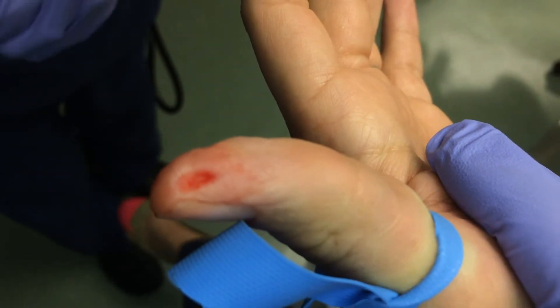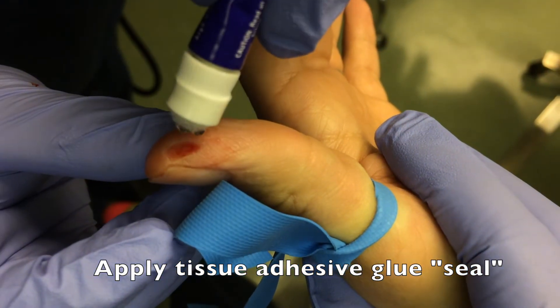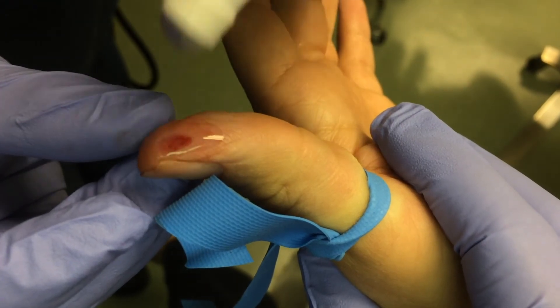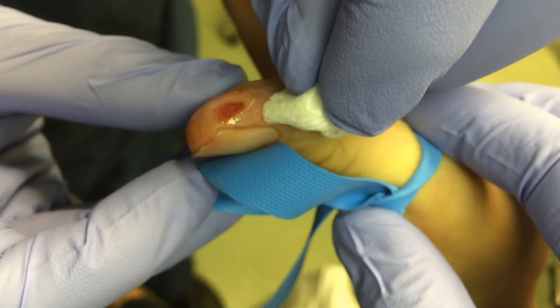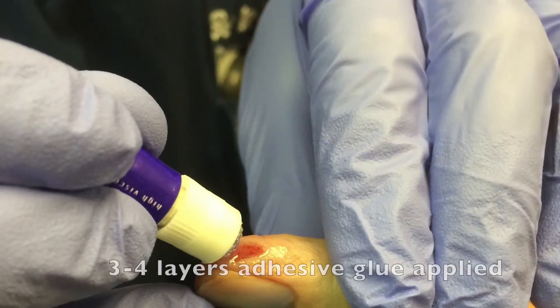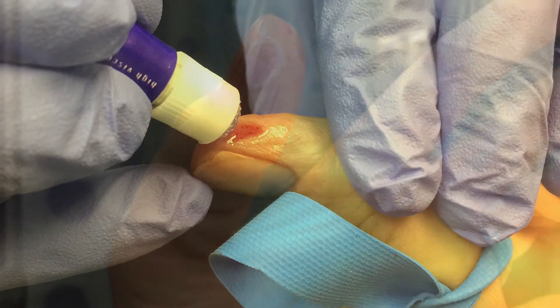Once you're sure that's the case, you can proceed to the next step, which is the application of a layer of tissue adhesive glue to act as a sealant over that avulsion injury. You can go ahead and dab away extra glue around the wound edges. Ultimately you're going to apply about three to four layers of adhesive glue over the wound.